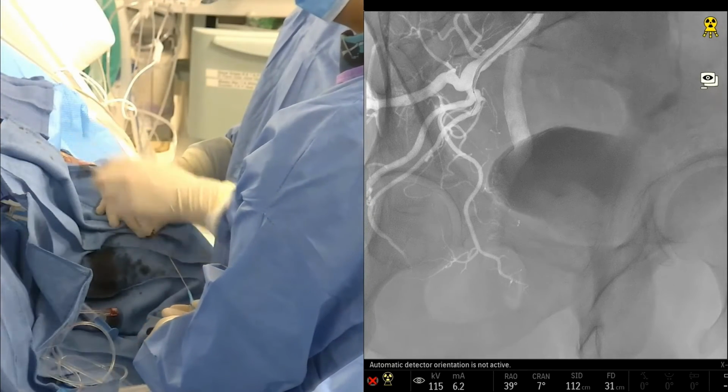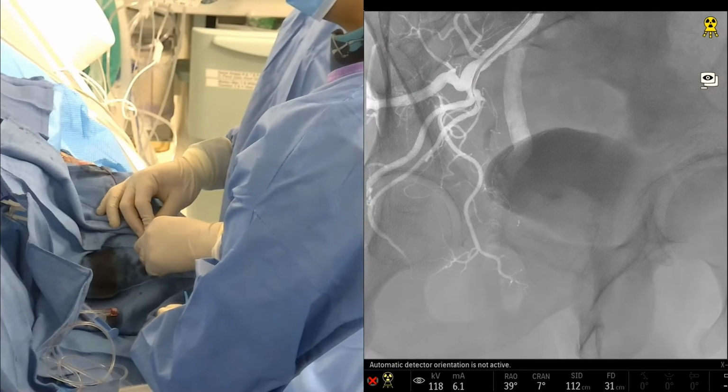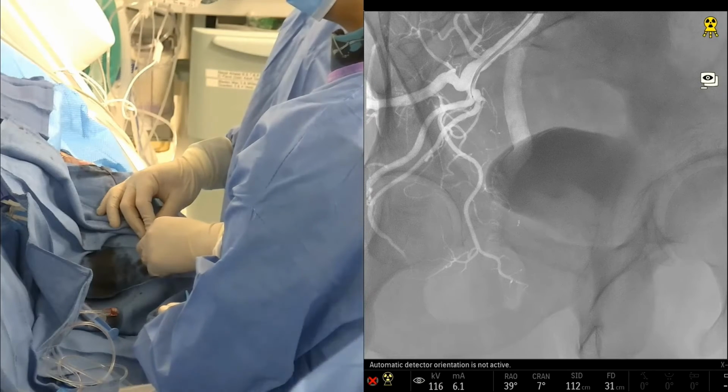But I think a lot of people have to consider the curve on this, so 1s can be probably the most challenging to get into. I can't anticipate there are going to be a problem working here with the True Select, or are you with a Sniper right now?